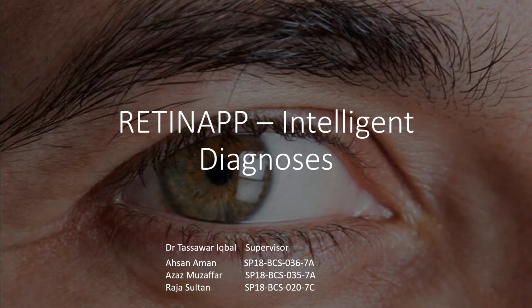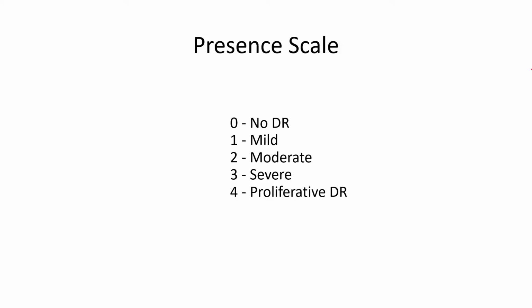Retinapp is the short form for diabetic retinopathy application, in which we are going to determine the severity of diabetic disease in a person. The presence of diabetic retinopathy in each image will be determined on the scale of 0 to 4.